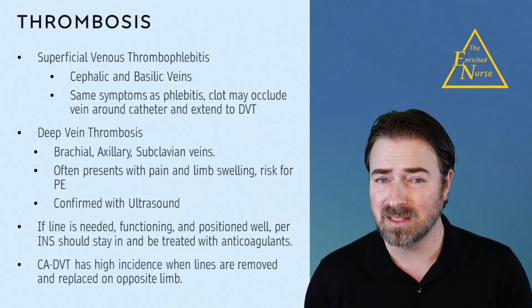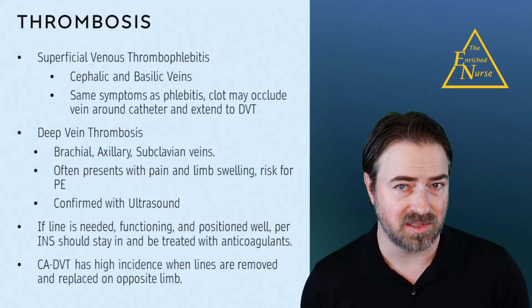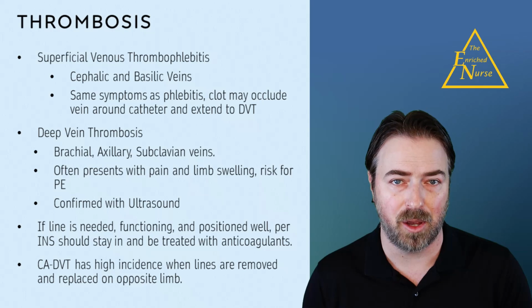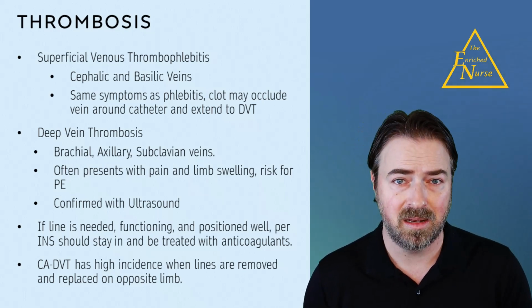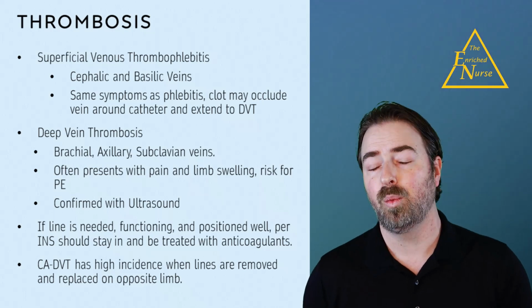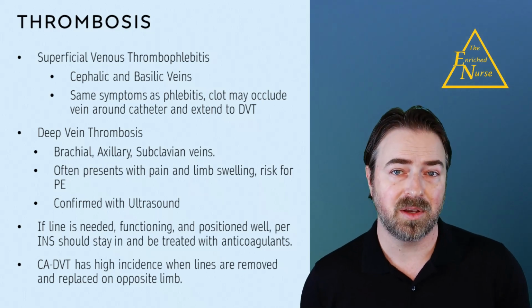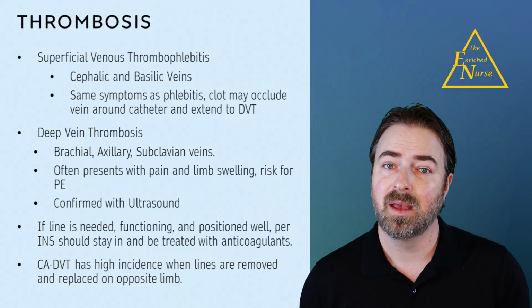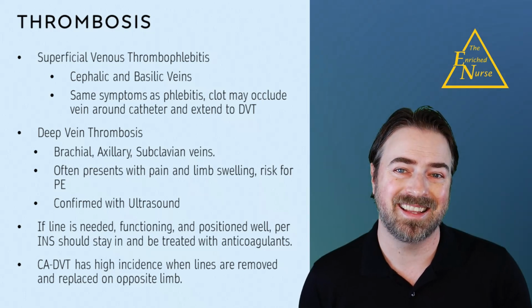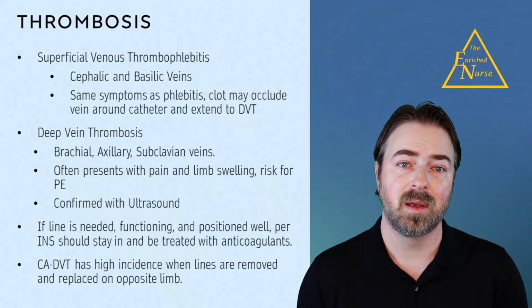Catheter-associated DVT is often silent and doesn't have obvious signs and symptoms, but when symptoms arise, it is due to obstruction of flow. You may see pain, edema, and redness in the extremity, shoulder, neck, or chest. When a PICC is inserted, circumference should be measured and documented. If swelling arises, circumference should be double-checked and measured approximately 10 centimeters above the AC.